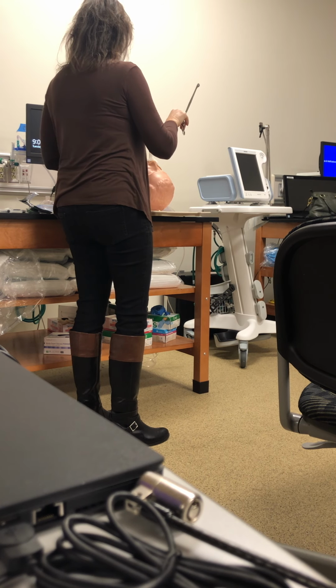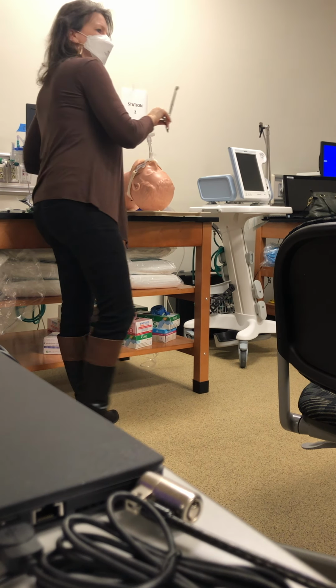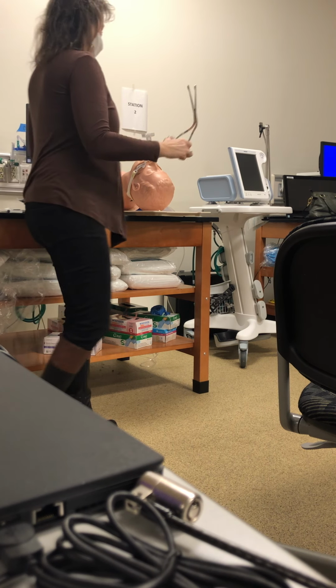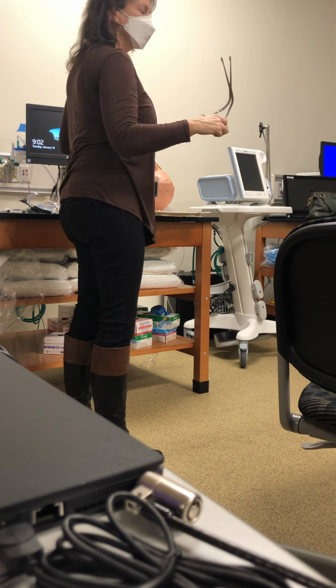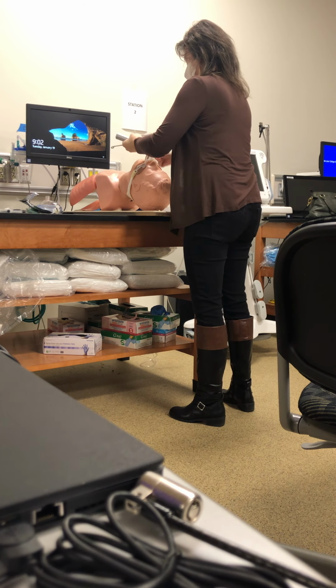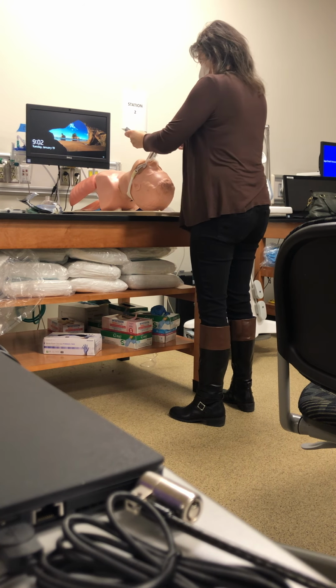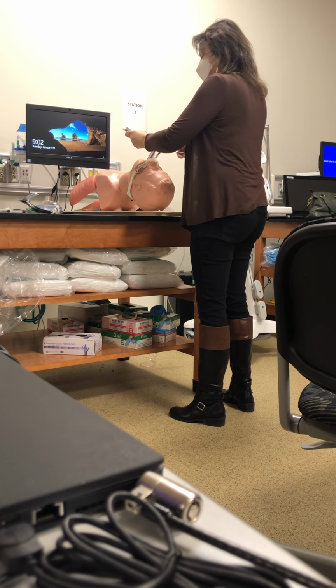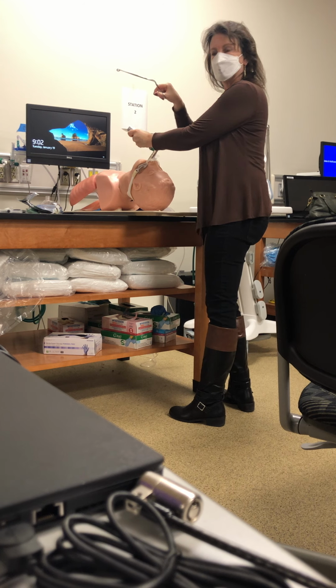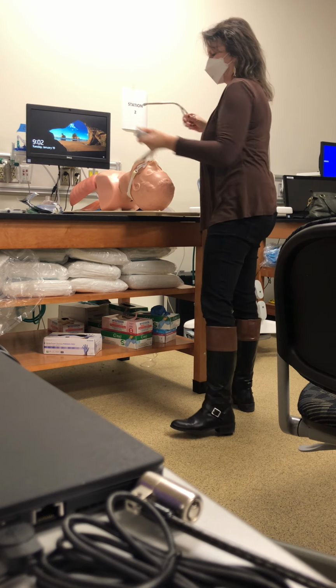These are what you call McGill forceps. These are McGill forceps, okay? So this is to assist you. So I see the tube at the back of the throat. This is going to assist you with pushing the tube through the cords. That's what McGill forceps do. Through the cords, and we're nasally intubated.